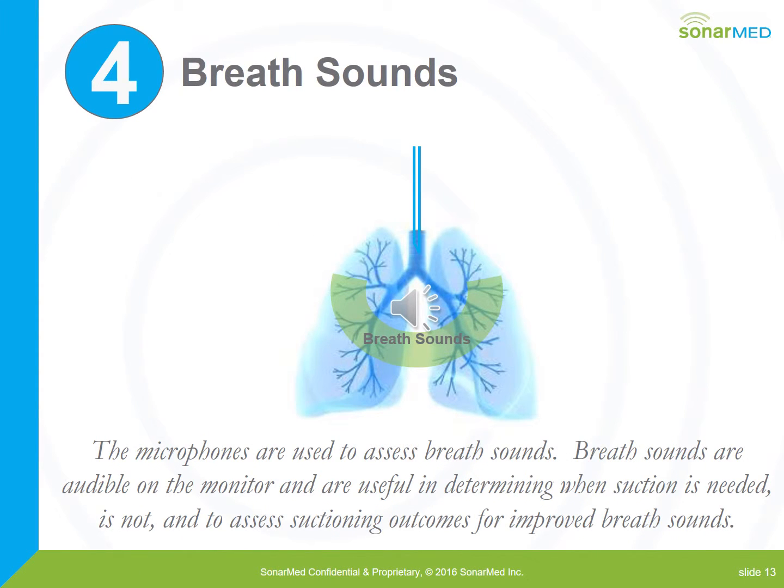We talked about before that you can hear the breath sounds using the SonarMed airwave, and that can also be a very powerful tool.